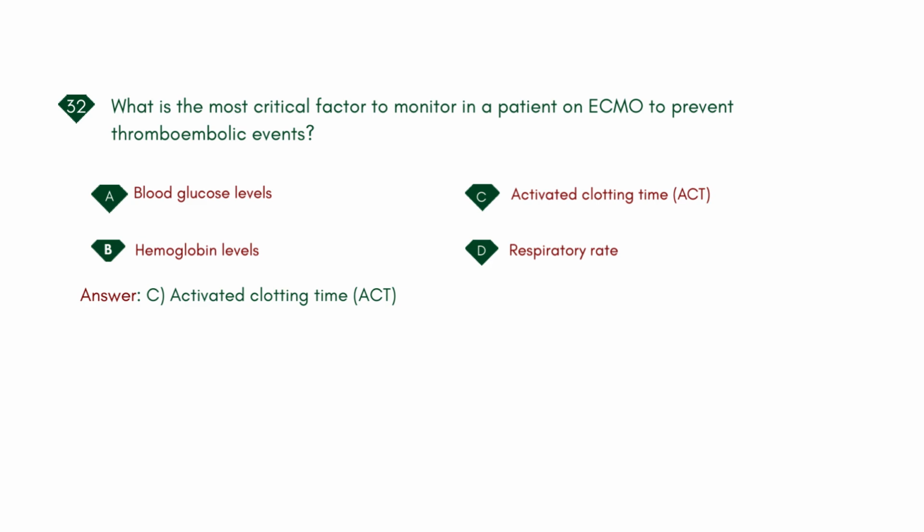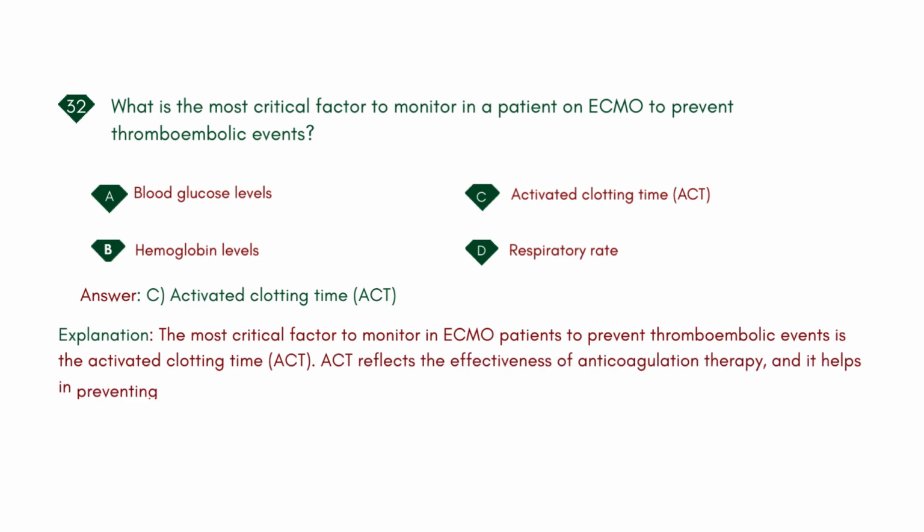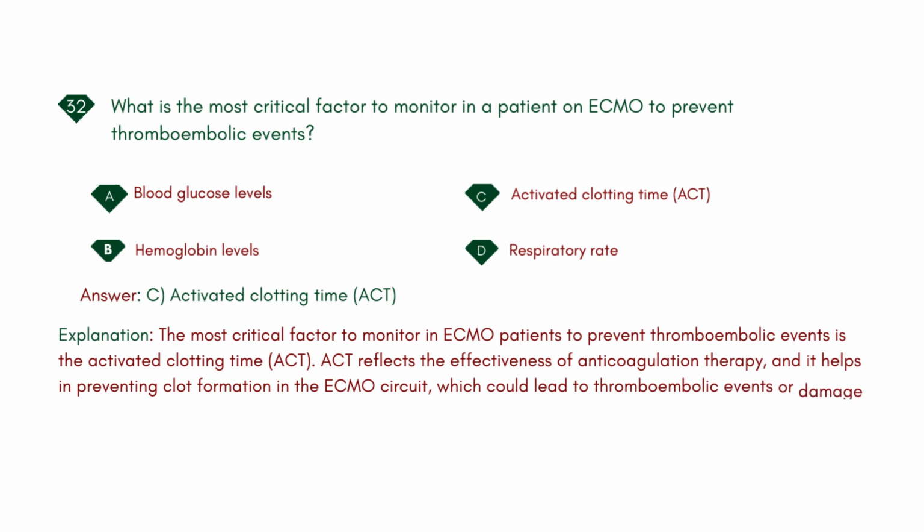Activated clotting time, ACT. Explanation: the most critical factor to monitor in ECMO patients to prevent thromboembolic events is the activated clotting time, ACT. ACT reflects the effectiveness of anticoagulation therapy, and it helps in preventing clot formation in the ECMO circuit, which could lead to thromboembolic events or damage to the circuit.